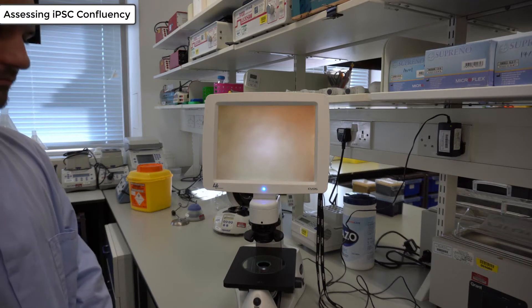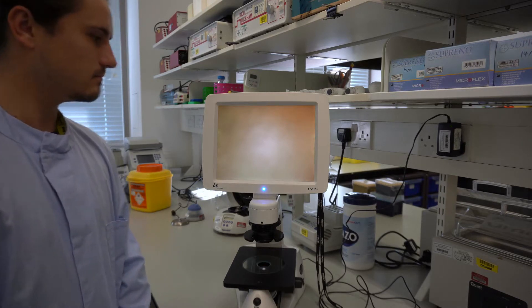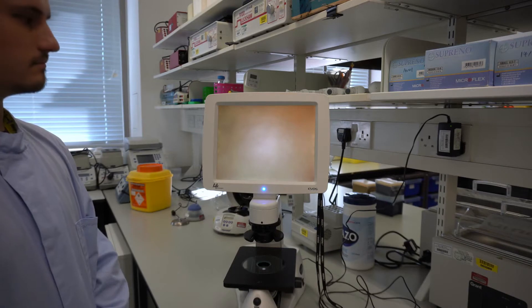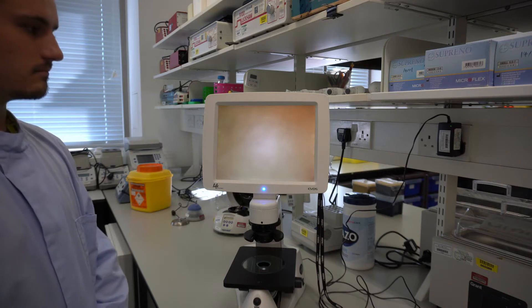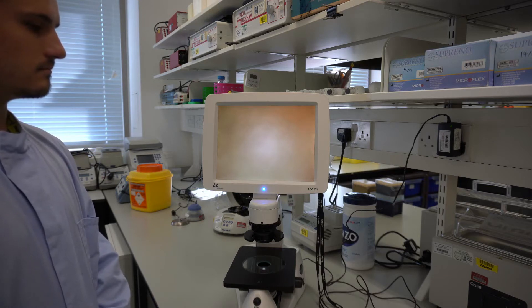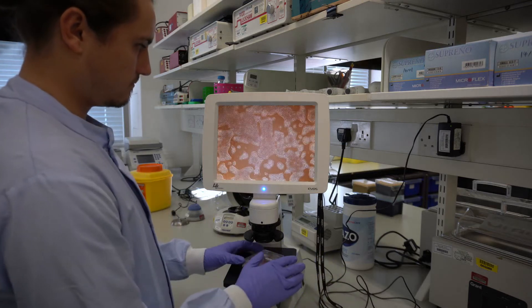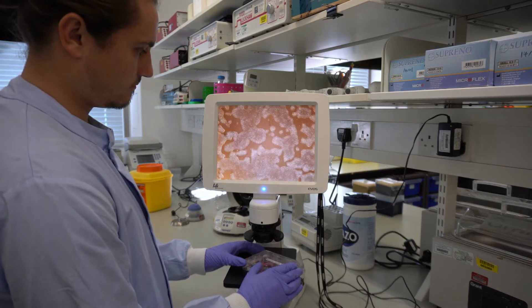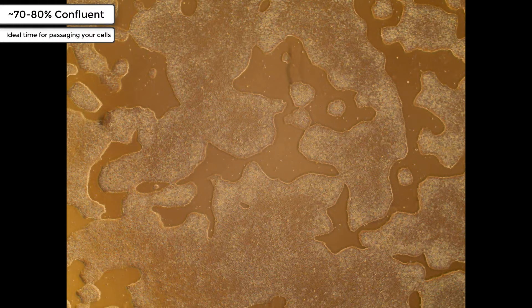Every day you should check the confluence of your cells. Confluence just means the percentage of the well that's covered by the cells. Usually we would have a microscope inside the hood for this, but today we've just got an EVOS on the bench top for the purposes of filming. You should aim to passage your cells when they're about 70-80% confluence — it's just an estimation of how much of the well is covered by the growing cells.